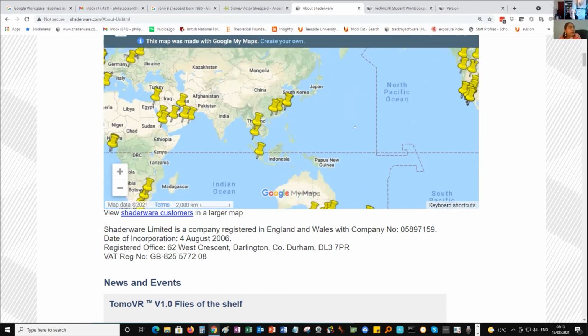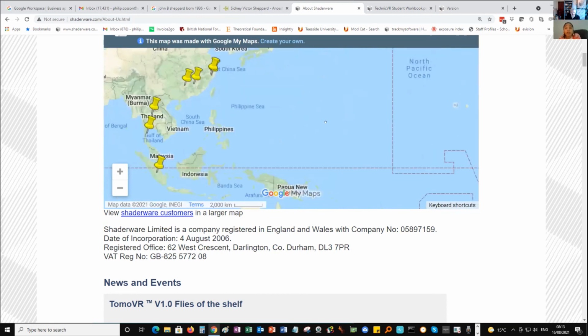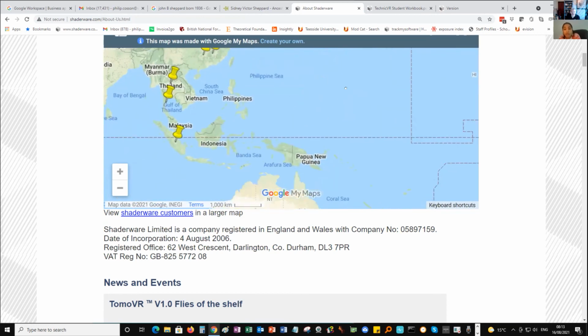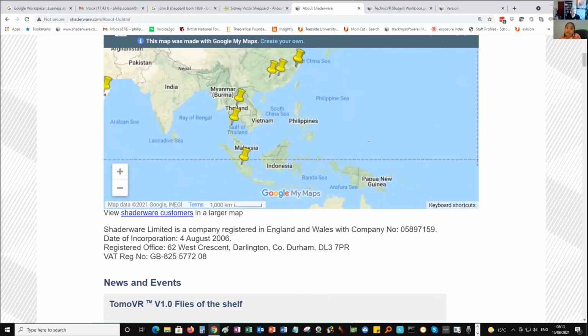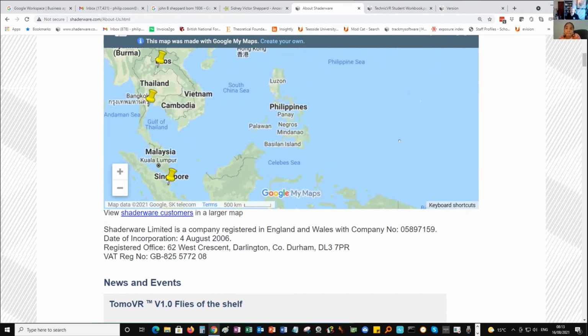Right. There are a lot of radiologic technology schools here in the Philippines, like the medical imaging schools. And this is a good selling point for our university. We'll be getting this one, the first in the Philippines.